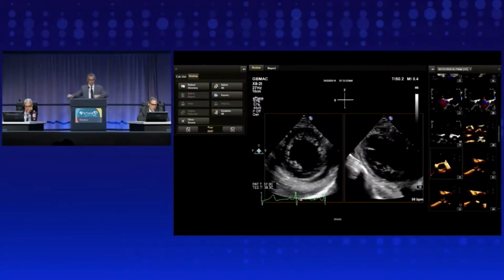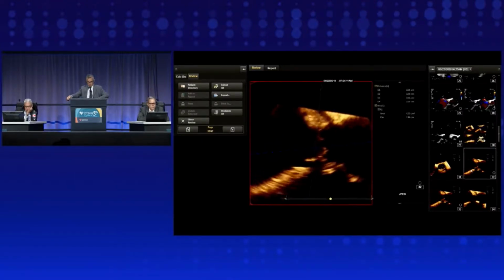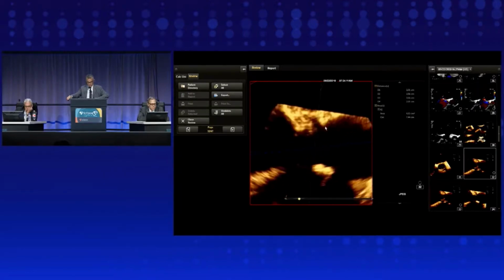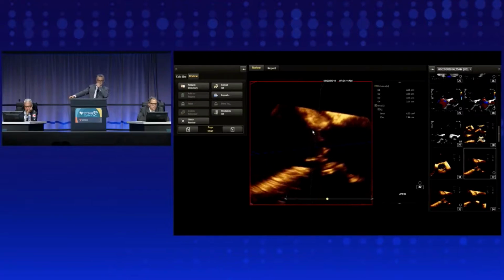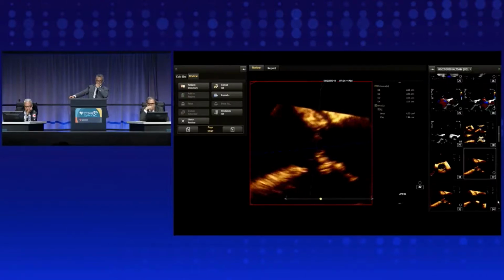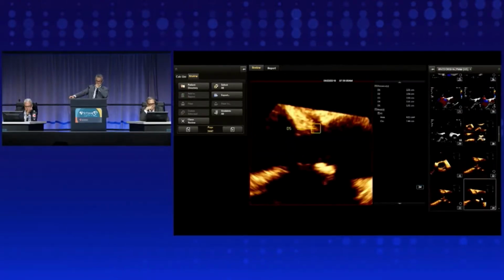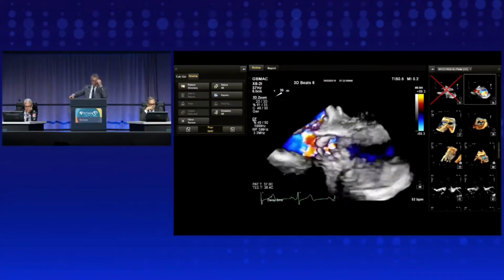Now, we used the 3D to assess not only the size, which was predetermined by CT, and we confirmed a very similar sizing as you see it here. But we also had an opportunity then to identify the offtake of the left coronary in 3D in this long axis view. You may appreciate the offtake here, and then you see the left coronary cusp leaflet coming out of that coronary ostium and going back and forth, again suggesting the high risk for potential obstruction during the TAVR procedure if we were not to do BASILICA. This also lends itself to measure and confirm the height, which I measured at 11 millimeters for this particular situation. And unless there are any questions, we're going to stop here with the pre-assessment images.